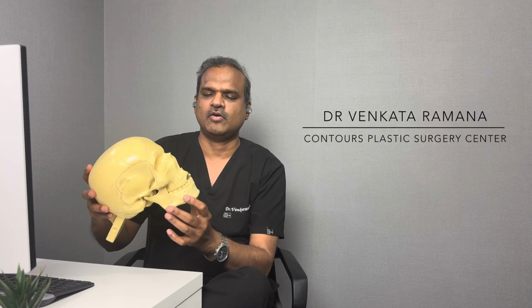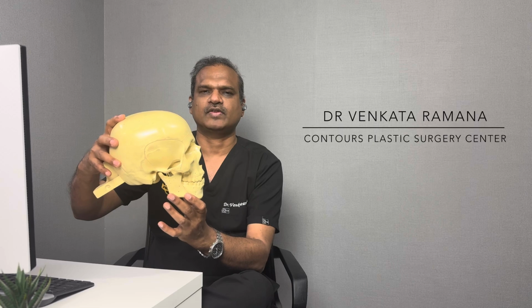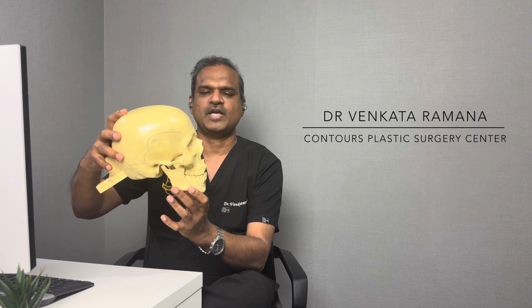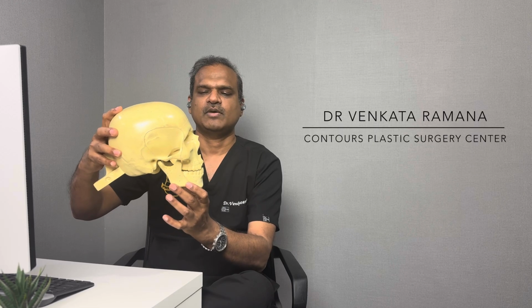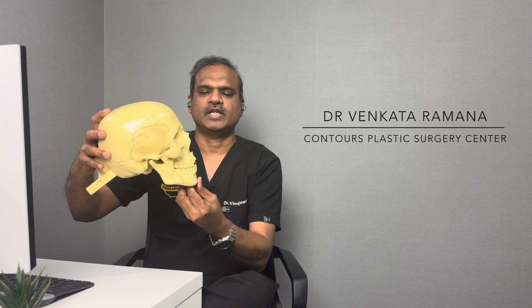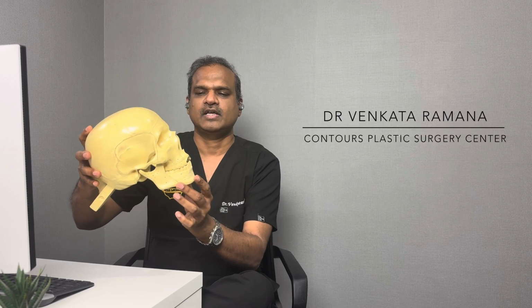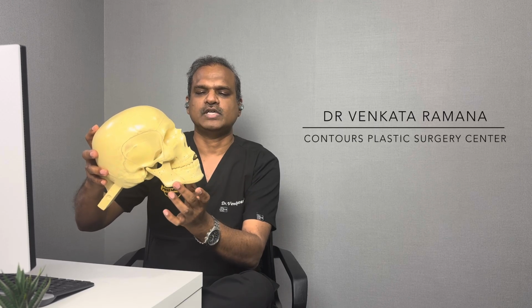This is a model of a skull with the lower jaw. This is the lower jaw, this is the upper jaw. So in these proportions we will assess in the simulation images whether the chin is adequately protruded or retruded, whether it is adequate or not. Once we feel that the chin is not adequate, let me show you how these are done.